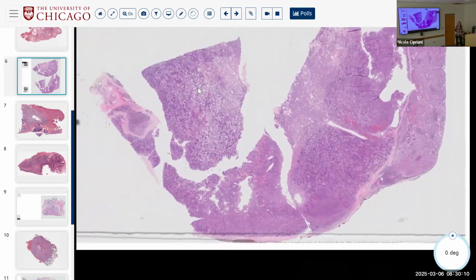So in the pancreas, right, something with similar morphology would be called acinar cell, right? In the salivary glands, it's acinic cell. We don't normally use the trypsin, the chymotrypsin, whatever those enzymatic immunohistochemical stains are, like they do in the pancreas. We do not use them here because they don't express that.